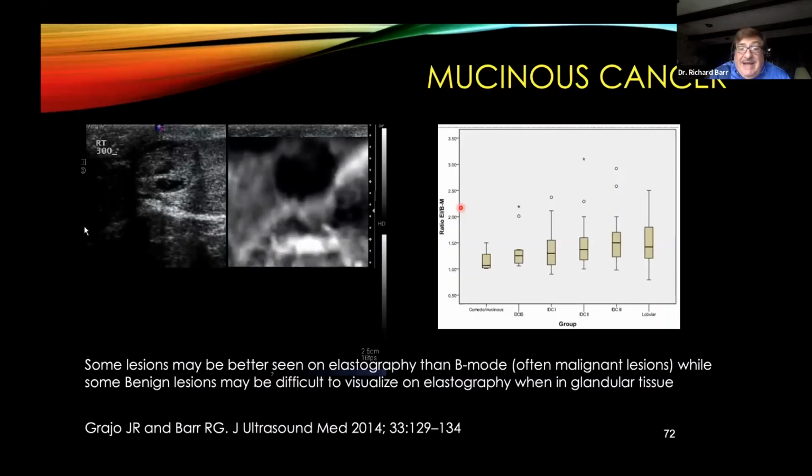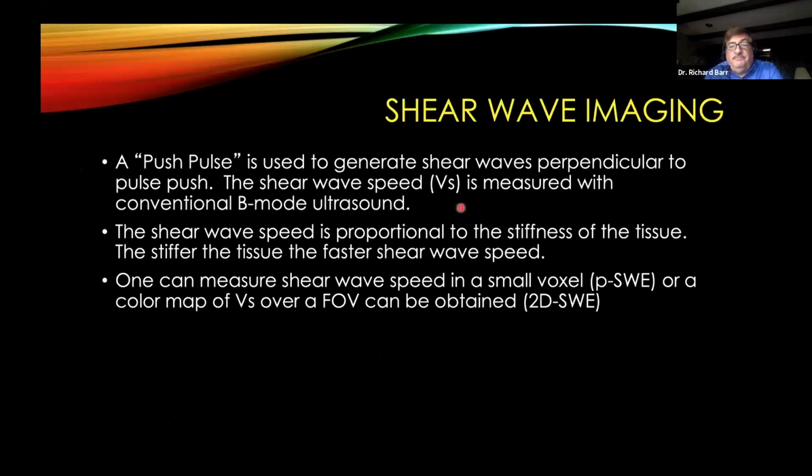So we always biopsy if we have a ratio of 1. And you can see as the grade of the cancers gets higher in the invasive ductal cancers, the length ratio actually increases statistically. The lobulars tend to be all over the place. And again, we think that's partly because we do such a bad job in measuring the size in B mode.